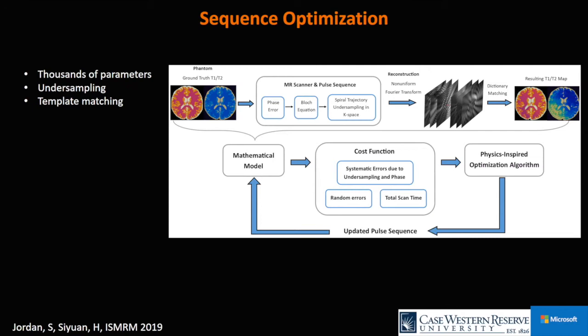In the meantime, during the acquisition, especially in vivo scan, the current MRF implementation applies very high undersampling factor, which means that we are dealing with aliasing artifacts in all the images.